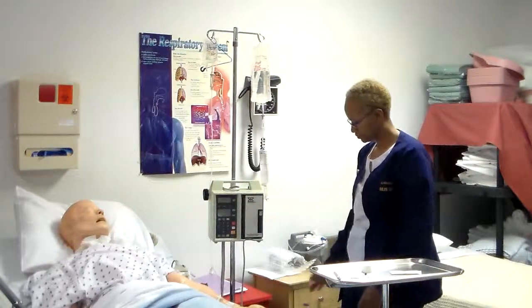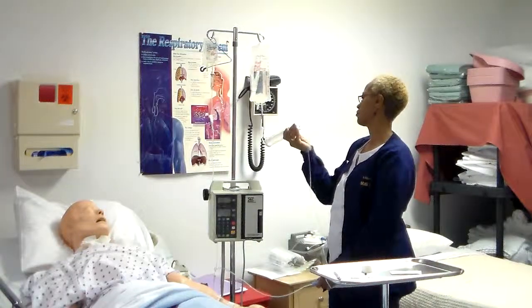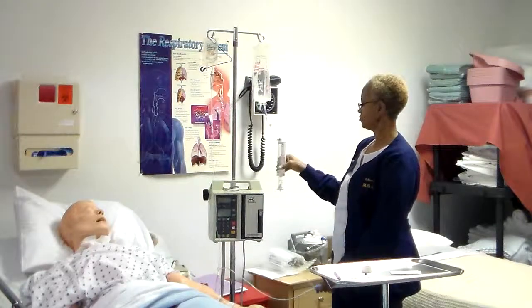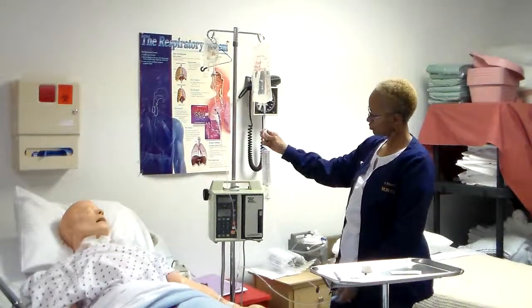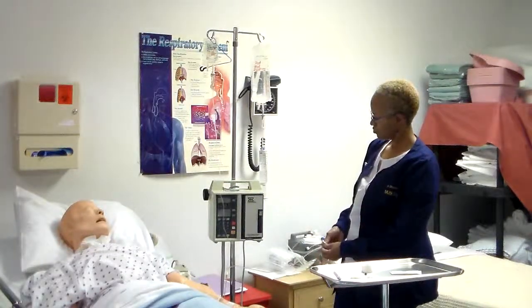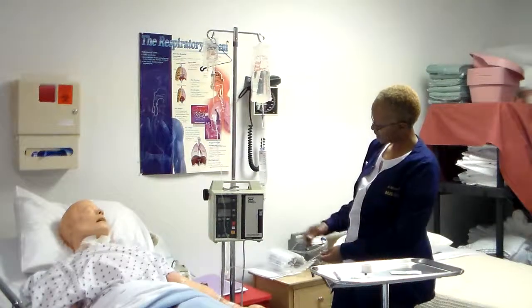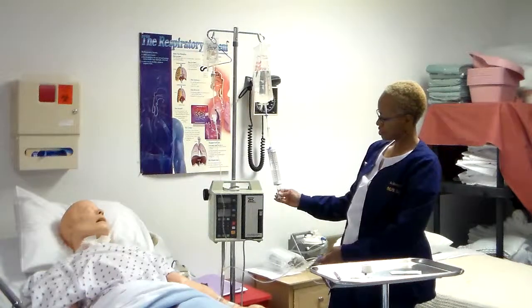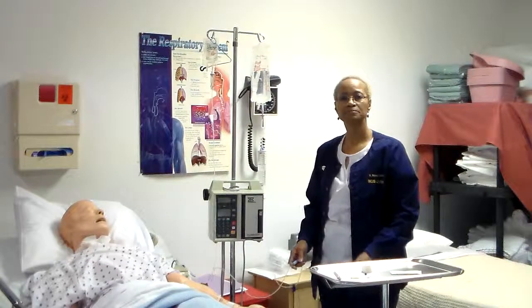All right? Gently rotate Volutrol between hands. Regulate IV infusion rate to allow medication to infuse in time recommended by institutional policy, a pharmacist, or medication reference manual. Okay, so I will regulate my drip here. A little bit harder to regulate. Okay. If it's not set on the pump, I would count my drips, okay?